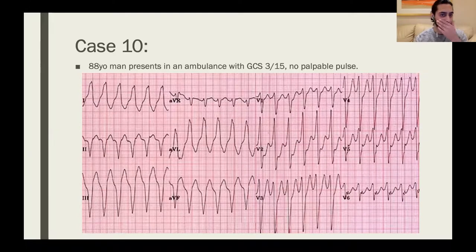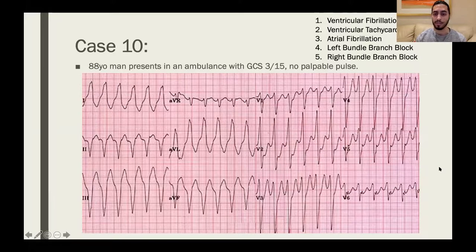What's the diagnosis? The patient comes in basically in cardiac arrest. You see this ECG. The consultant hands it to you. What's the diagnosis? There are your options. I think many of you may get this just because it's got quite an obvious morphology.